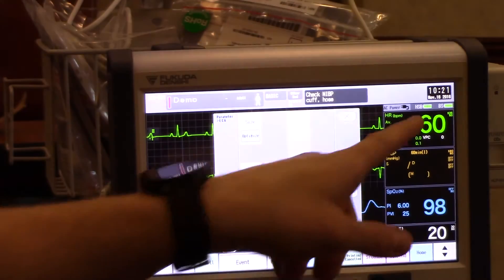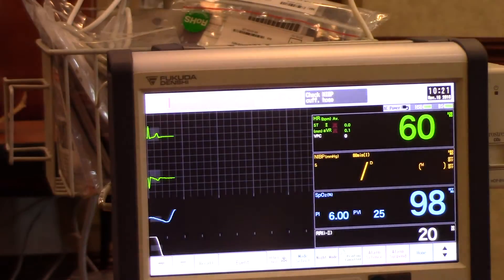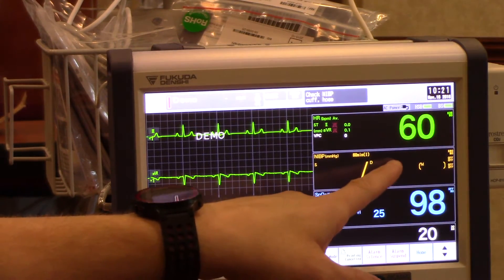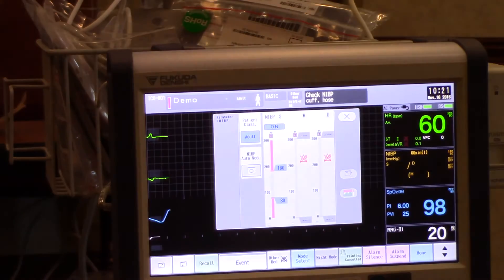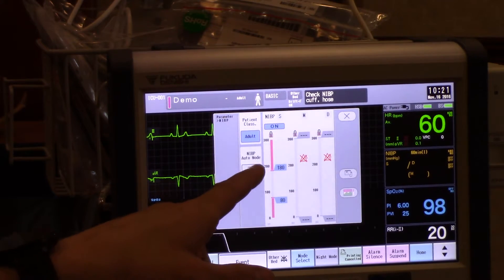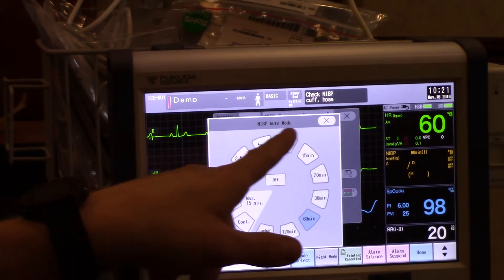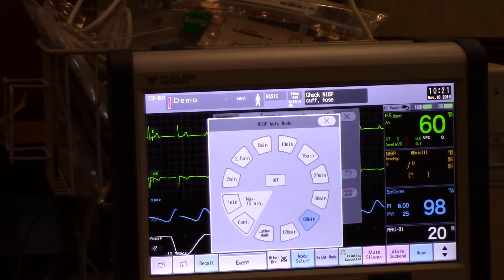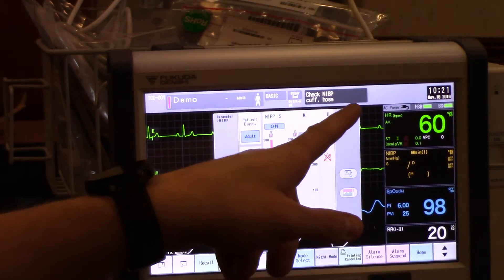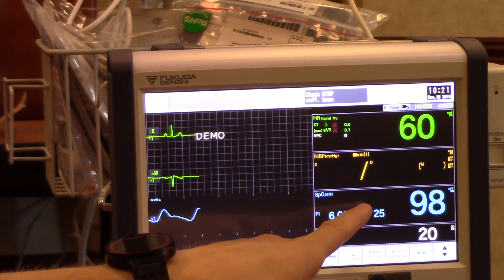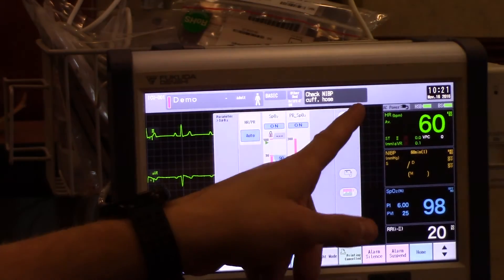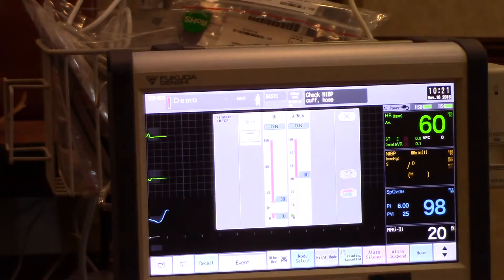If I press the heart rate I can back out of those menus. The same holds true for my blood pressure — the first screen will take me to my alarm parameters as well as another place where I can select my NIBP interval. Also with my SPO2 I have my alarm changes and my respiratory rate.